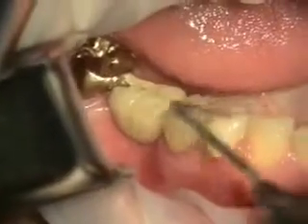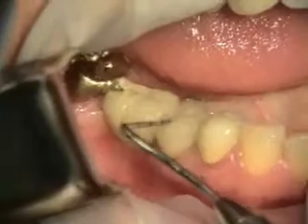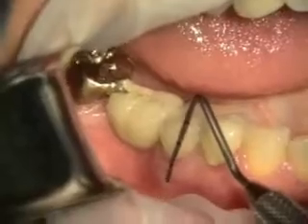Today we're taking tooth number 29 out. It's got a fracture here and it's failing. It's got a little infection here.